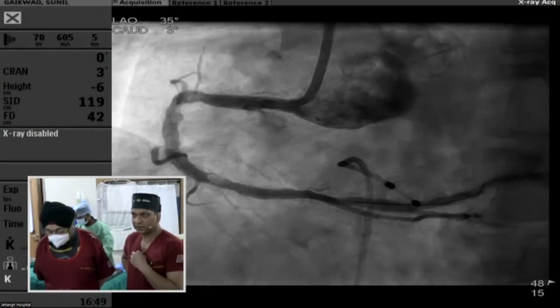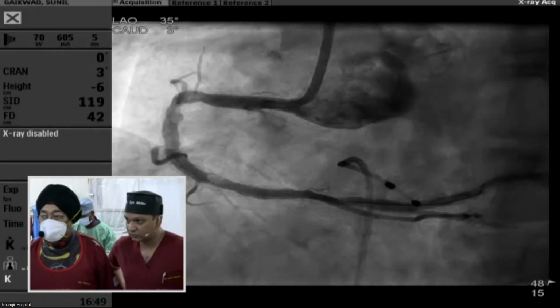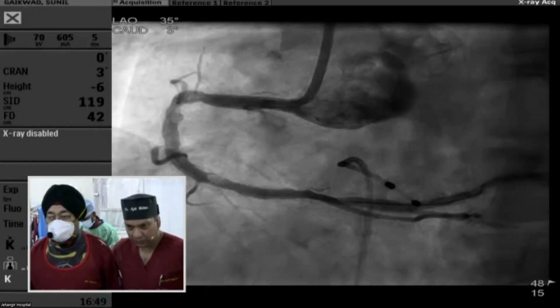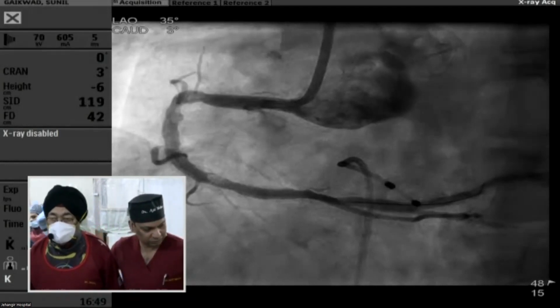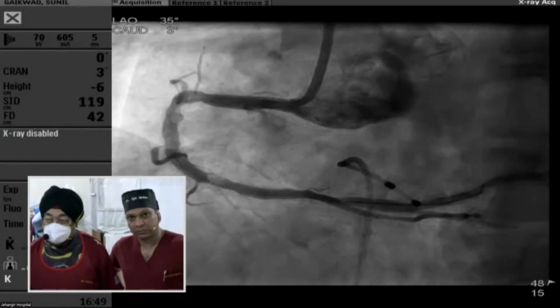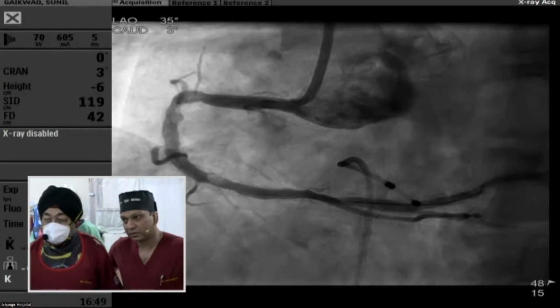So we did a rotational atherectomy for the distal also with a 1.75 burr. And that's where we had left you. I think we'd seen the IVUS after the 1.75 burr distally. And this was followed by NC balloon at high pressure, and then 3.5, and then we stented distally with the 3.5, 38, and proximally with a 4 millimeter stent. So I'll show you the angio and the OCT images.